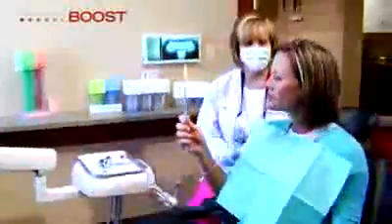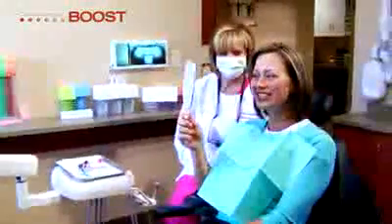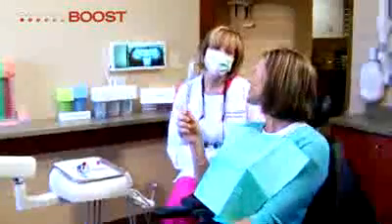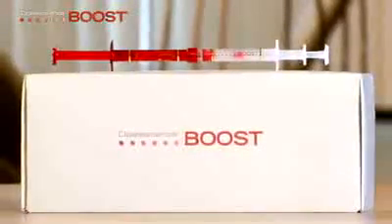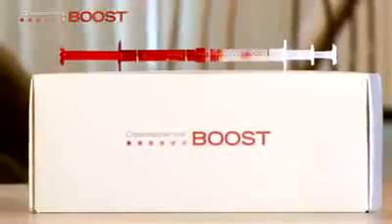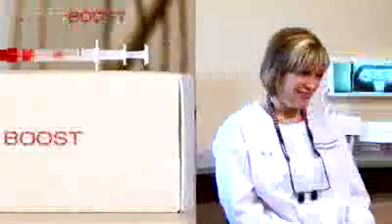The total procedure typically lasts 60 minutes, with 3 to 4 applications occurring. If additional whitening is desired and no significant tooth sensitivity is observed, schedule the patient for repeat treatment at least 3 days following the initial treatment. Be certain to read the product instructions, warnings, and information for the patient contained in the package, and advise the patient accordingly. Most all clinicians who provide in-office bleaching follow up with tray bleaching.